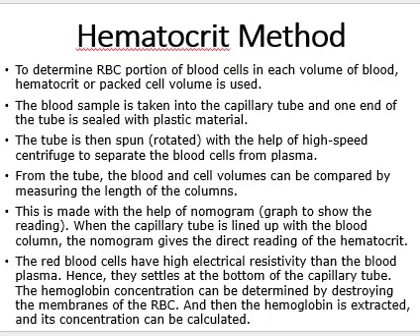After the separation of the plasma and blood cells, we can find two portions in that capillary tube. One is red in color and another is golden yellowish in color. The golden yellowish color is the plasma, and the red color is the blood cell portion.